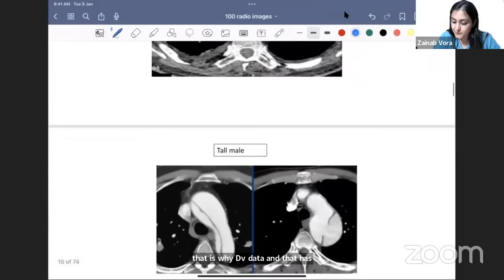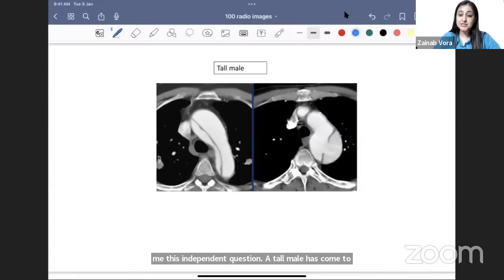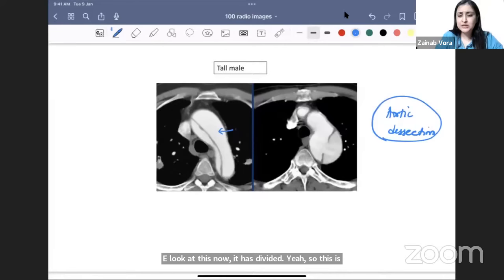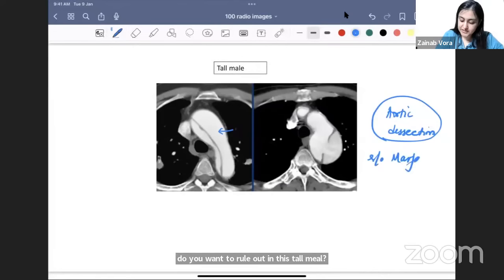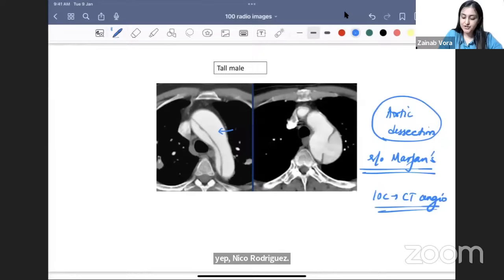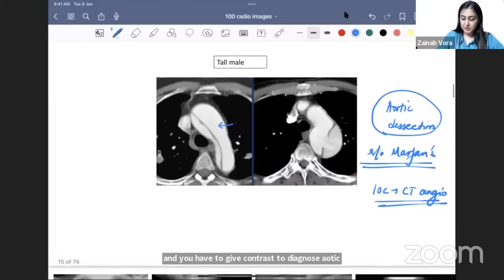A tall male with acute chest pain: CT angiography shows a banana-shaped aortic arch that has divided — this is aortic dissection. The tall male history prompts you to rule out Marfan syndrome, which has a very high likelihood of aortic dissection. Investigation of choice is CT angiography with contrast — you must give contrast to diagnose aortic dissection.